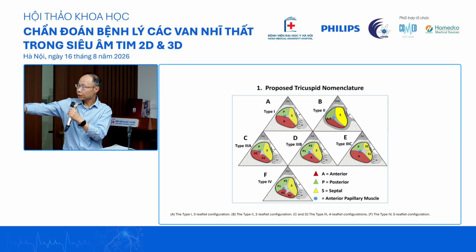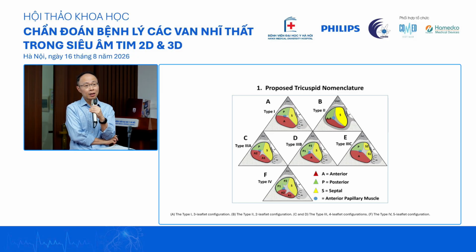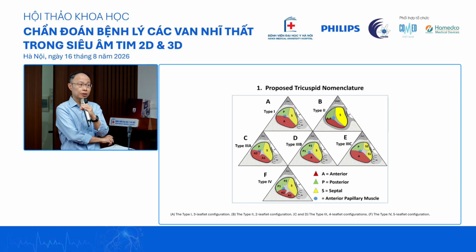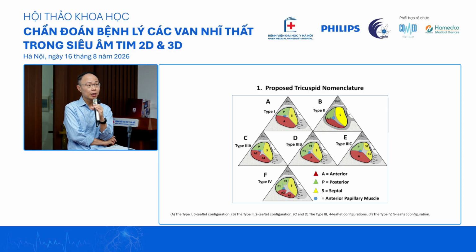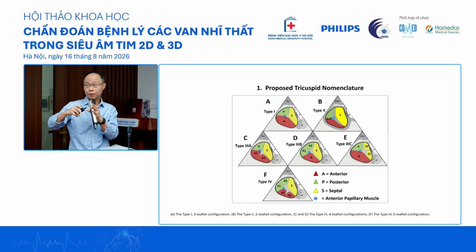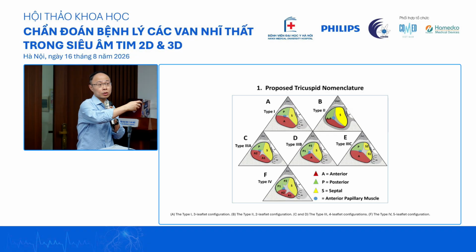if you look at the configuration and the geometry of your tricuspid annulus, it is saddle shaped. If you pay attention to Dr. Tran's talk, he may have gone a little bit fast just now because there's so much information. You realize that as the patient develops functional tricuspid regurgitation, the annulus does not get bigger in every dimension. In fact, it stretches itself out into the anterolateral direction, so it gets more and more distorted.